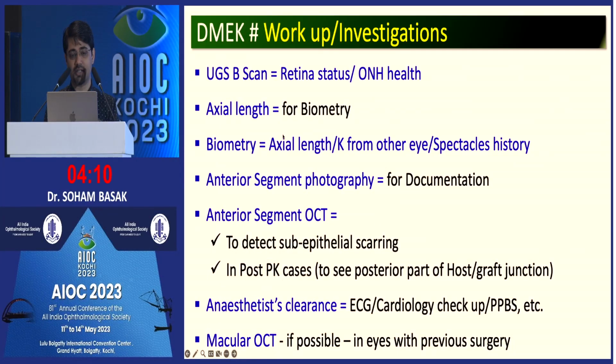And investigations: you can do a posterior segment evaluation using either an ultrasound or, if possible, macular OCT through a hazy cornea, biometry from both eyes if possible, and anterior segment photography for documentation and patient counseling. ASOCT is probably the most important tool to make sure and plan our surgeries.